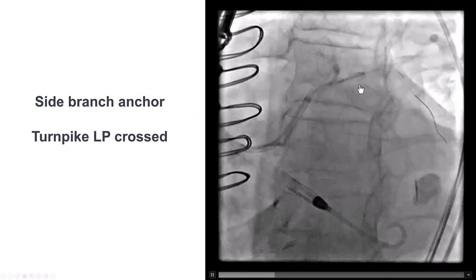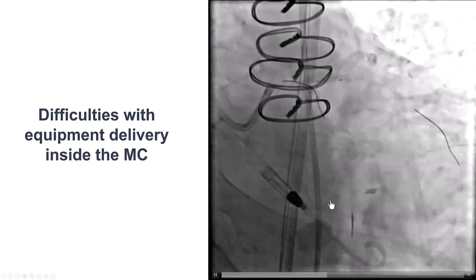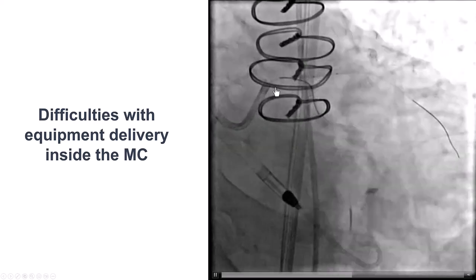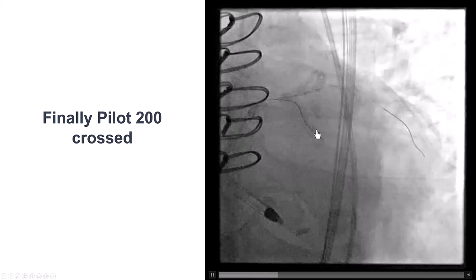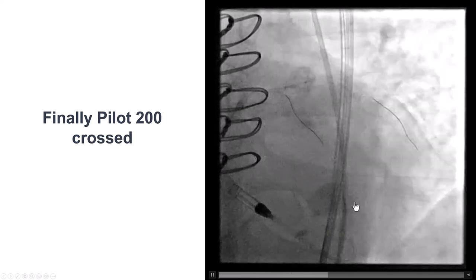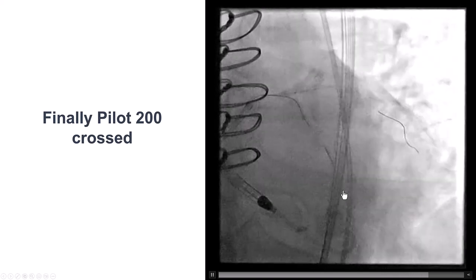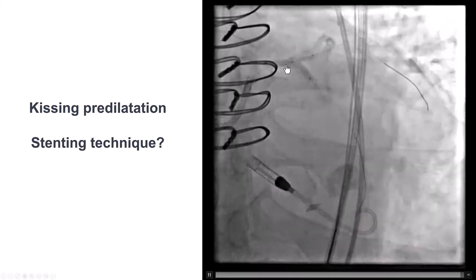The next step was to try a side branch anchor: a balloon was placed into the Ramus branch, which helped advance the microcatheter down into the circumflex. A Turnpike LP, a lower-profile microcatheter compared to the Corsair, was also used. There was still unexpected difficulty advancing wires through the microcatheter, likely due to significant tortuosity causing the microcatheter to kink. Eventually, using a polymer-jacketed Pilot 200, the wire was advanced further down into the circumflex. The Turnpike LP was then pulled back and the Pilot was exchanged for a workhorse wire, allowing dilation of the vessel.